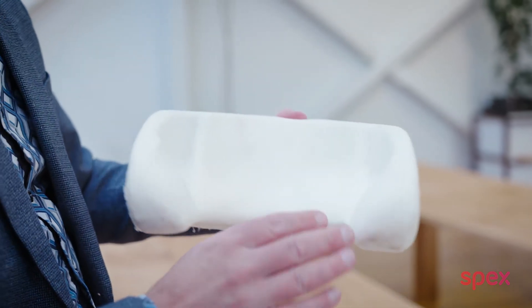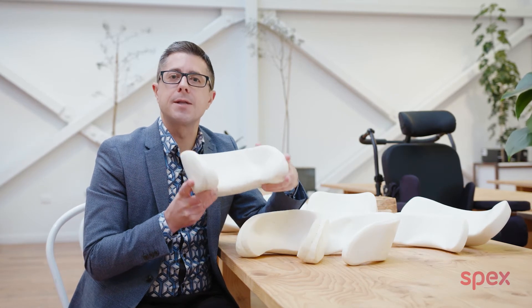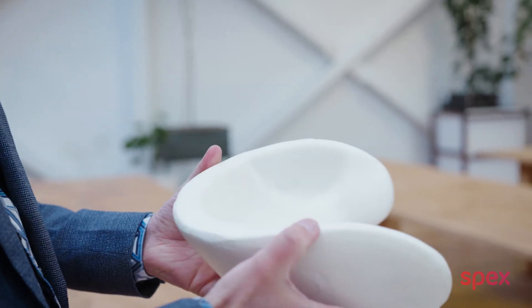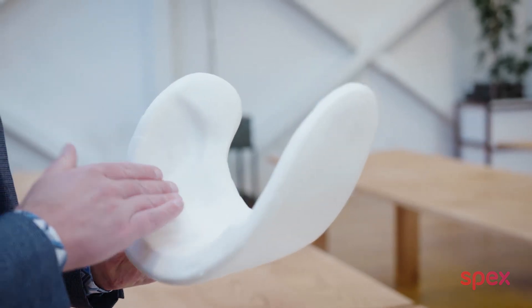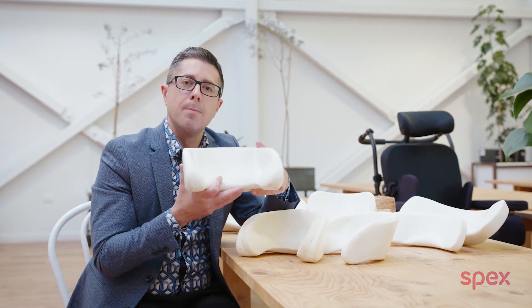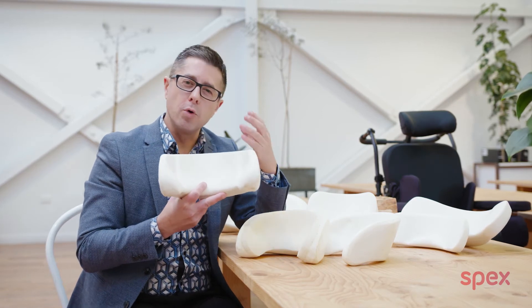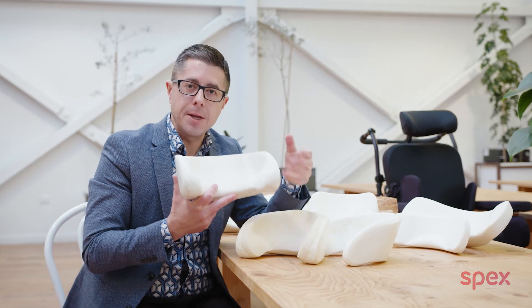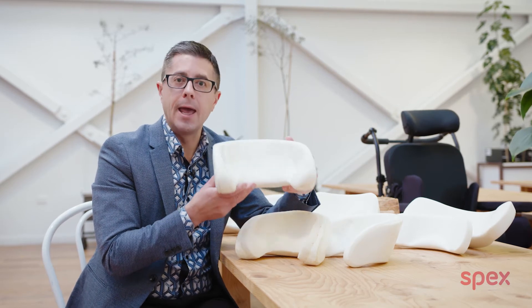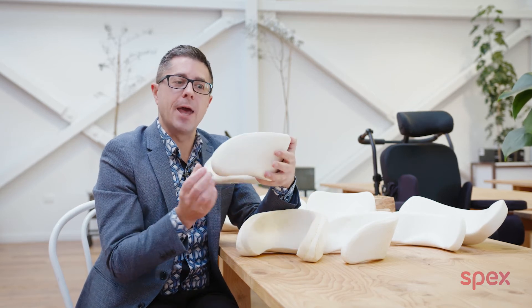Here we have our extended lateral head support pad. These head support pads used to be called the comfy head support pad — now we're just calling them extended lateral. We also have a standard lateral which is cut back by five centimetres. The extended lateral head support pad gives real deep contour and deep lateral control right round the head. It cradles the head in a very accommodating manner, meaning that for people with even complex shapes and complex head positioning requirements, the extended lateral head support pad really meets that in a one-piece solution.